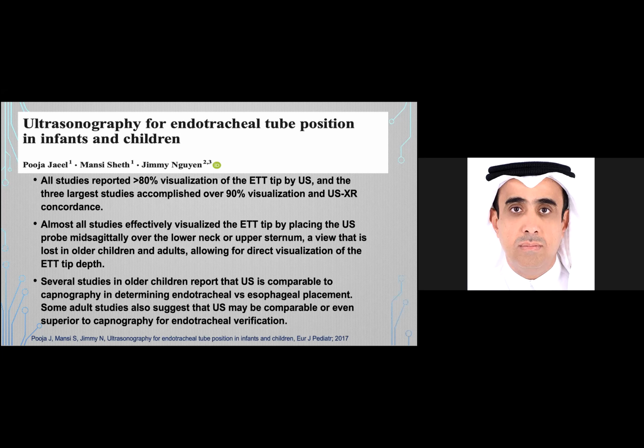Several studies in older children reported ultrasound is comparable to capnography, and some studies in adults found it more superior to capnography. How do we utilize this ultrasound?